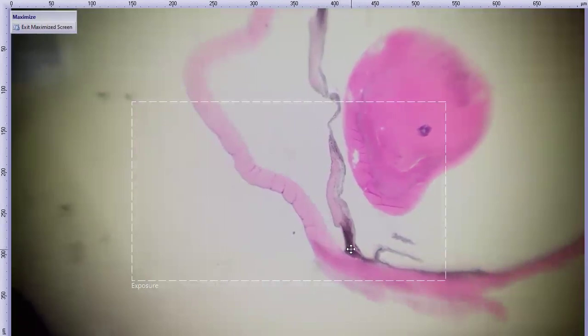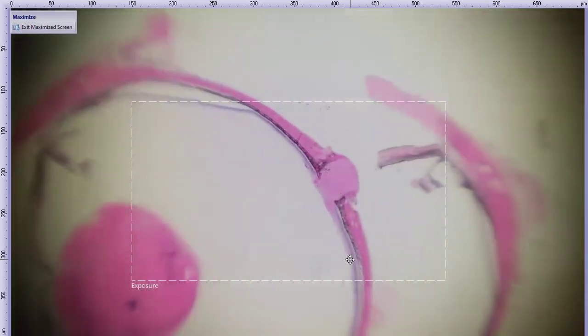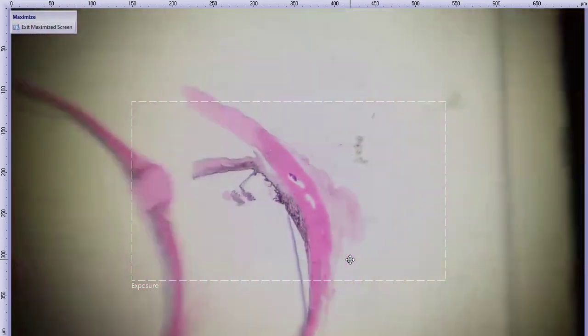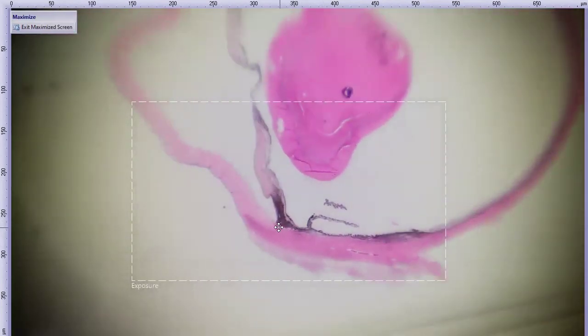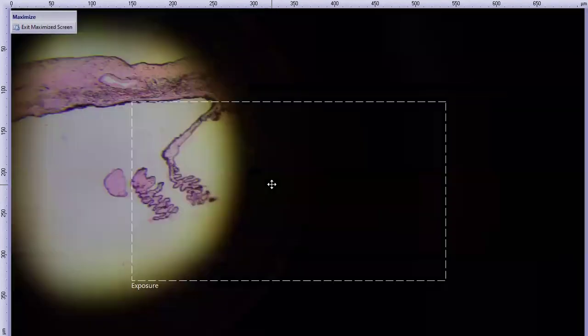The periphery of the iris is very dark at both sides of the eye there. The back is looking relatively normal. So there was no sign of glaucoma that we could see. And that darkly pigmented iris is not quite present here. And in this section, the ciliary cleft is open, whereas here it looks a little bit more collapsed. And here it's a little bit open as well, maybe artifactually. So let's just go ahead and jump in to the higher mag aspects of this eye.